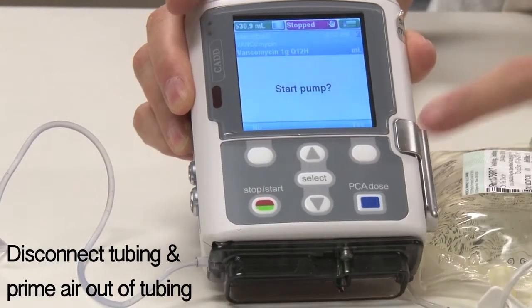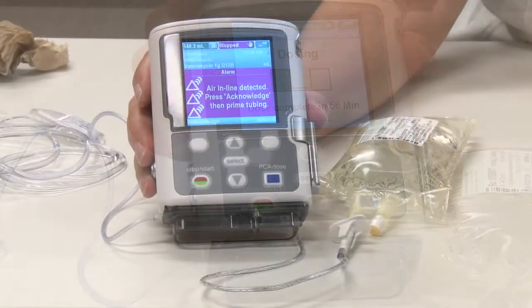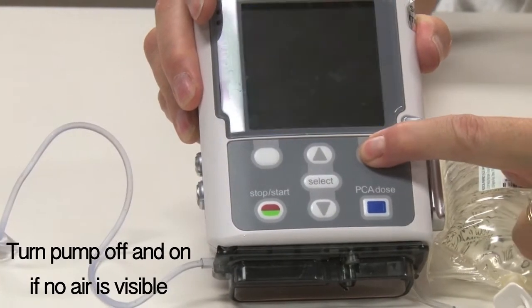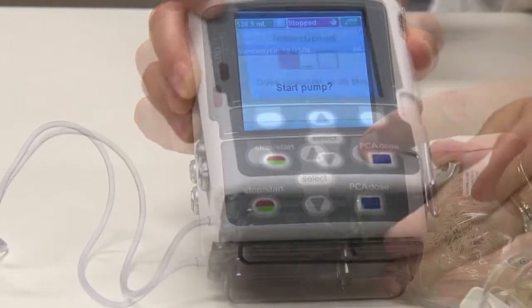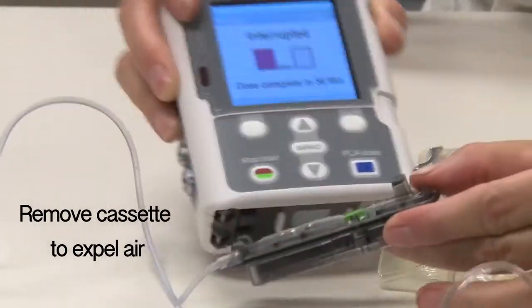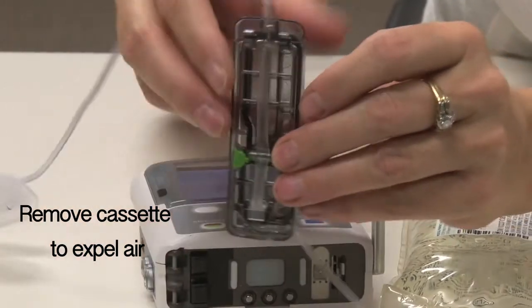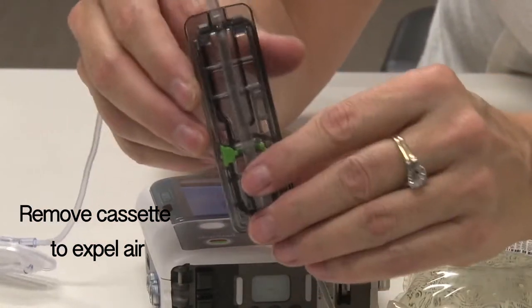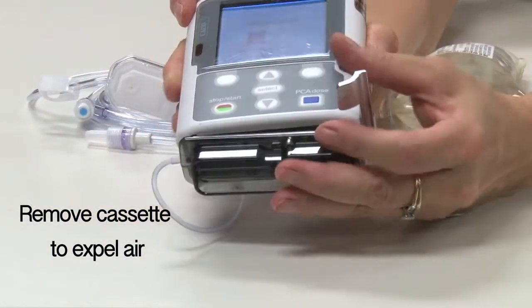Press Start and Yes to restart the infusion. When the pump alarms and there is no visible air, some patients have found it effective to simply turn the pump off and on and restart the infusion. If this is not effective, you can try taking the cassette off and inspecting it for air. Flick any air that may be in the tubing, ensuring that the tubing remains situated along the center of the cassette plate. Reattach the cassette and restart the pump.